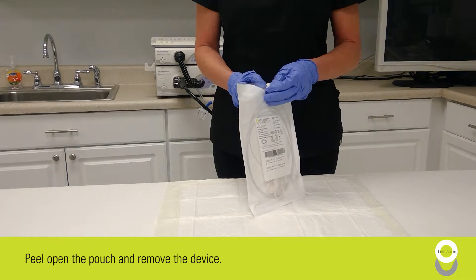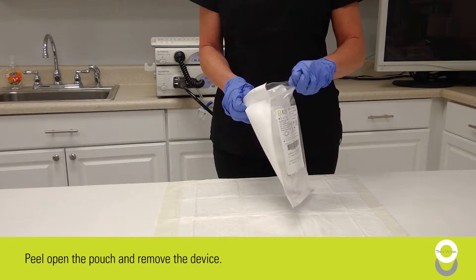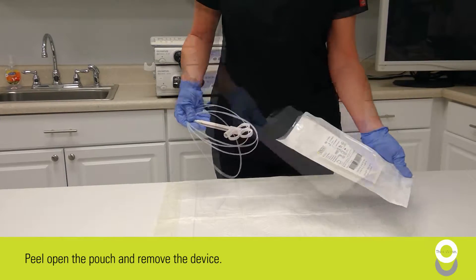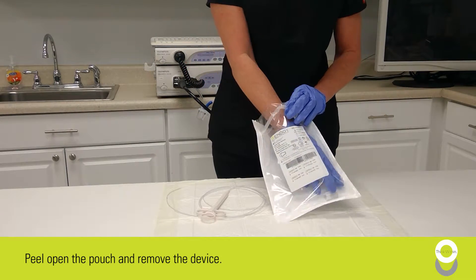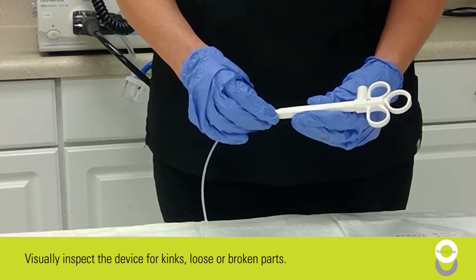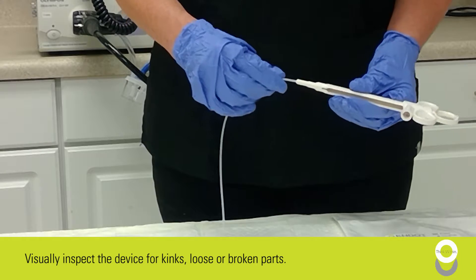Now we're ready to peel open the pouch and remove the device. Make sure to visually inspect the device for kinks, loose, or broken parts.